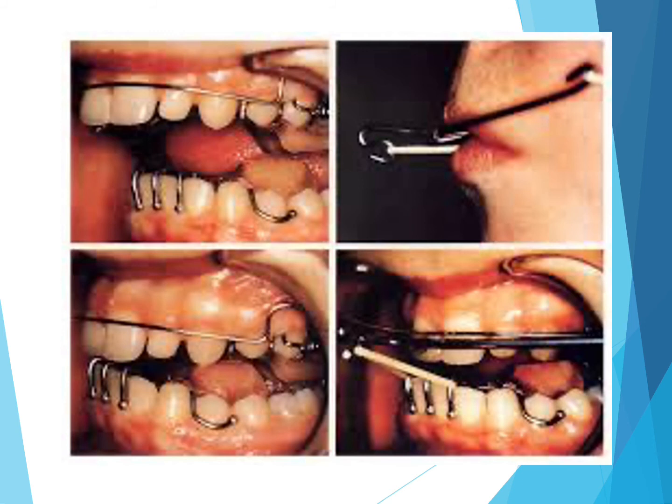Another additional part of the Concord face bow is a curved hook at the labial part of the face bow, where we attach an intermaxillary elastic from the hook to the ball clasp of the lower plate of the twin block to give intermaxillary traction. The Concord face bow is also attached to the headgear to give the extraoral traction and force.